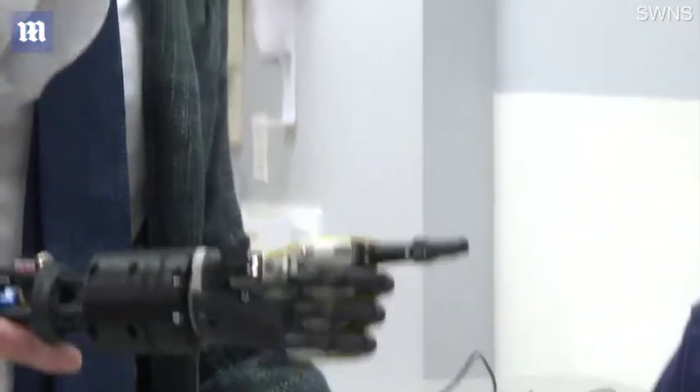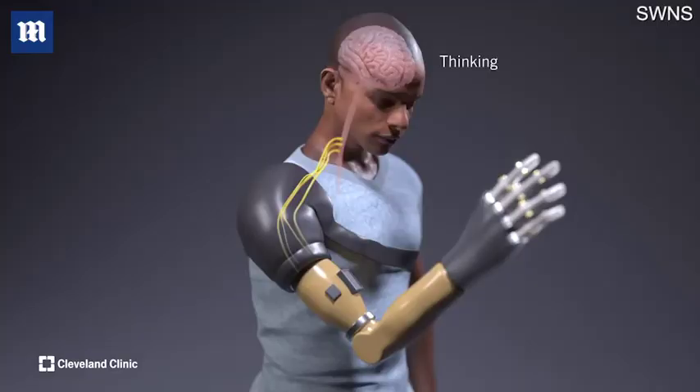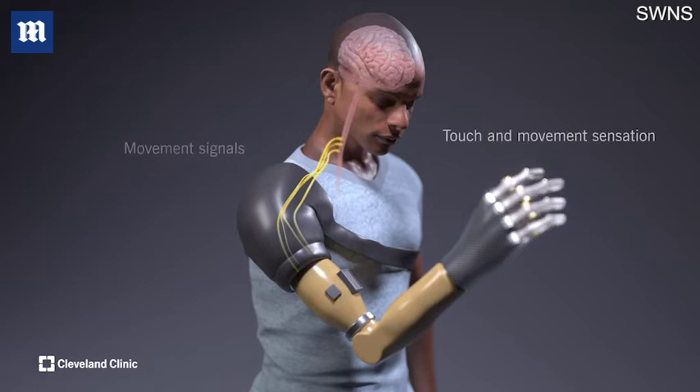We built the system using an off-the-shelf prosthetic as our basis, but then we put in high-level computing and we put in touch sensation and we put in movement sensation. So when you look at the limb itself, it looks like any other limb, and you can't tell that there's actually a highly sophisticated computerized communication and feedback system running inside of it.